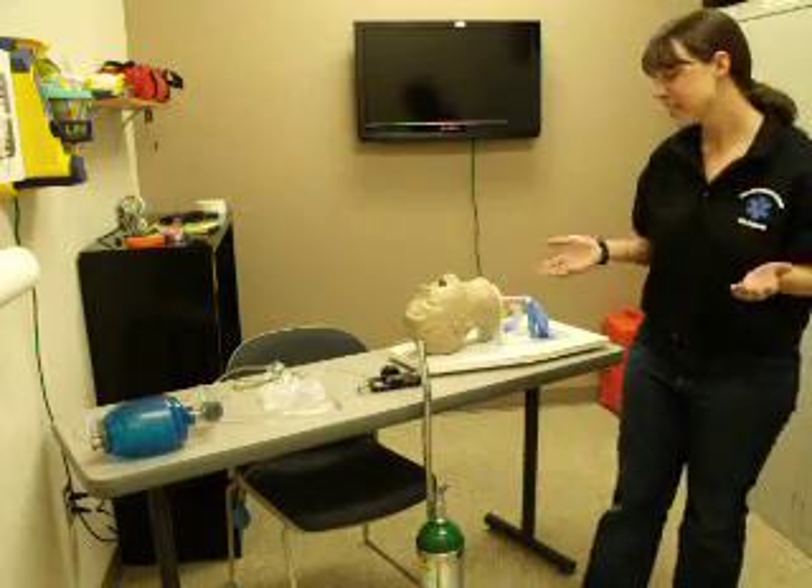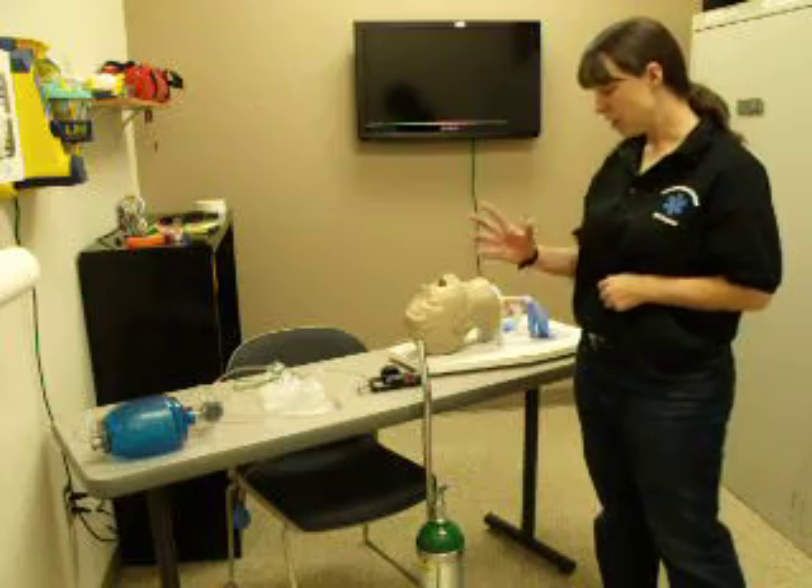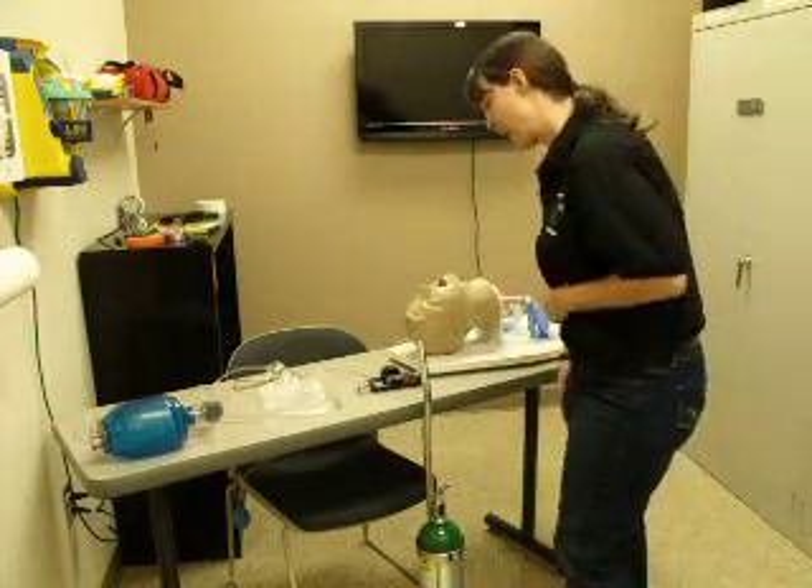BSI. I'm going to gather my appropriate equipment for the oxygen administration skill, which is the oxygen tank, the regulator, and the non-rebreather mask.